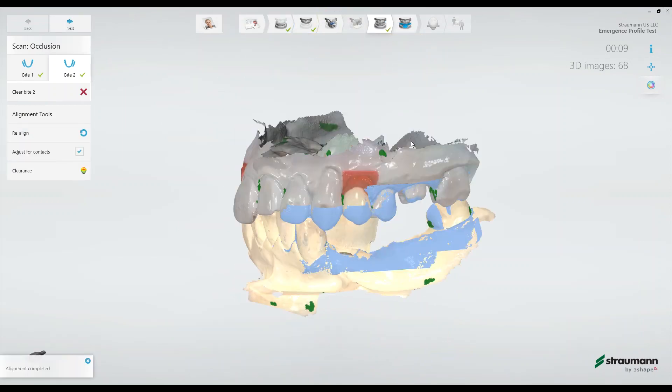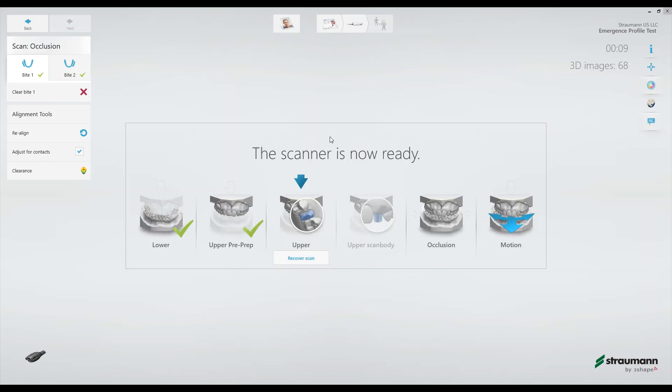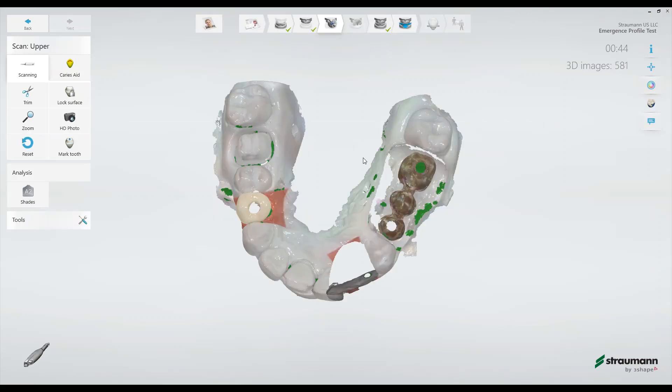At this point, the clinician will go back to the emergence profile scan page and remove the healing cap. Quickly, after the healing cap has been removed, we'll scan the emergence profile.